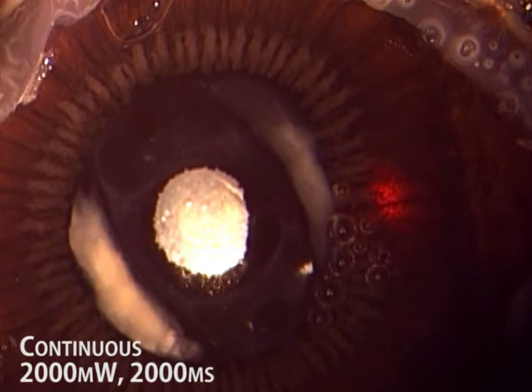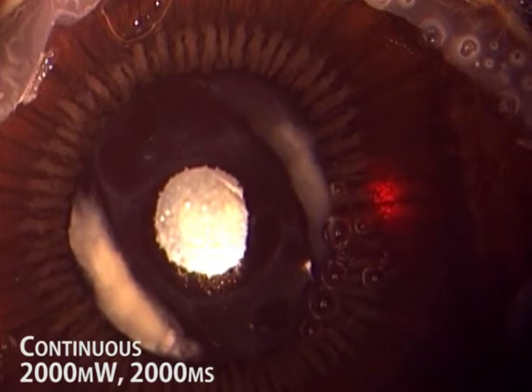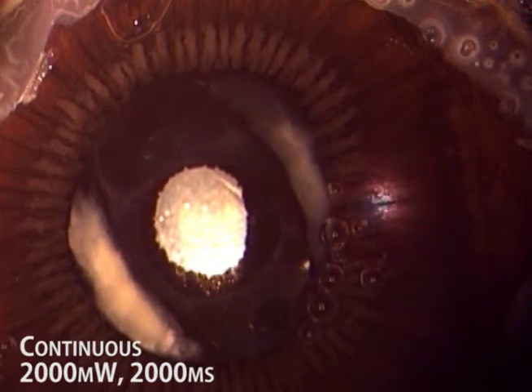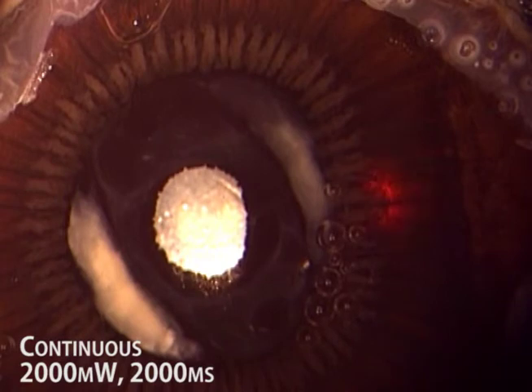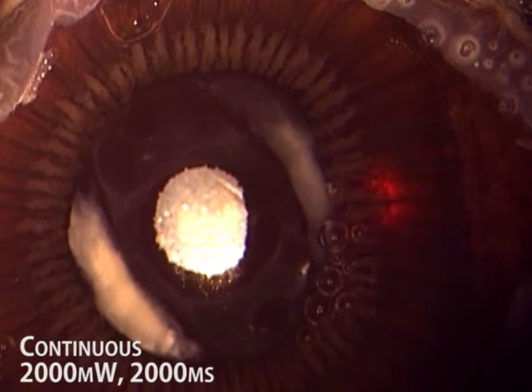In continuous diode mode, you can see the contracture of the ciliary processes and the pars plana.